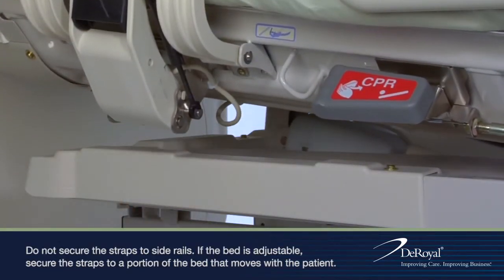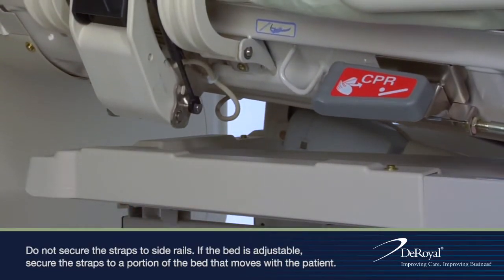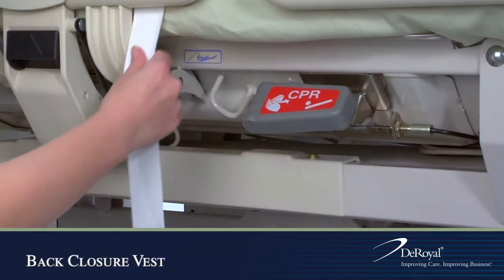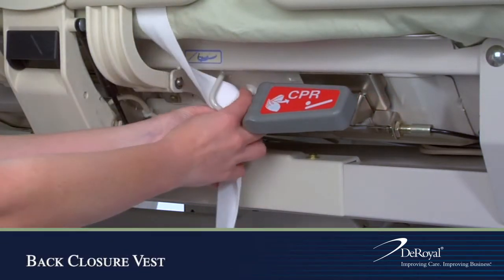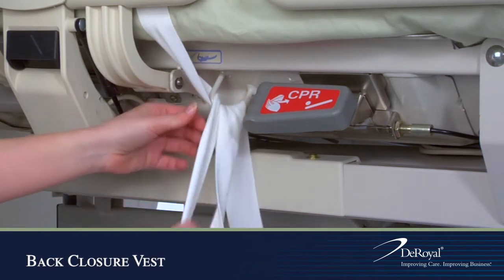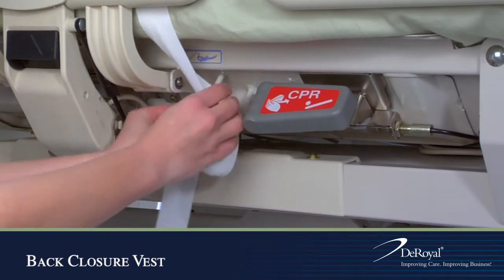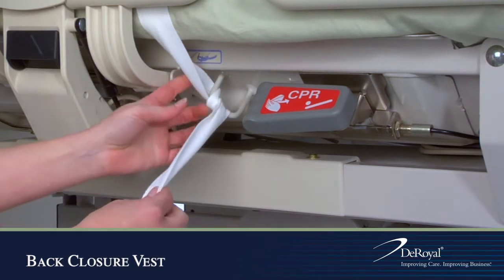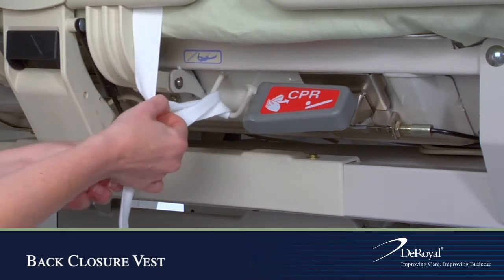To secure the straps, find a place underneath the bed that moves with the patient. Wrap the strap around the anchor two times, then pull the strap through by forming a single loop to create a quick release tie.